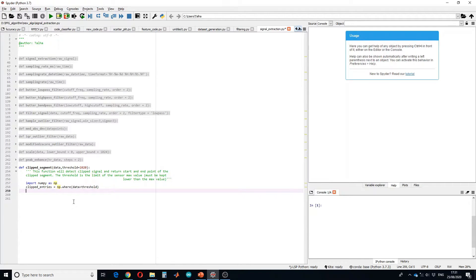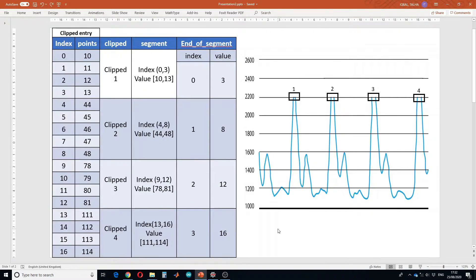The function will return the values which are above the threshold. The next step is to detect the end of each clipped signal segment. For example, suppose we have a signal which is clipped at four points — one, two, three, and four — and after running our first line we get clipped entries with indexes and different points.